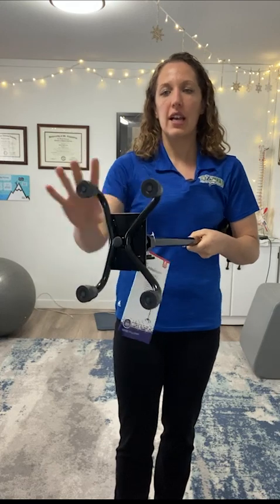Quad canes come in two sizes. I have here a small base quad cane. You can see it has four feet — one, two, three, four. This is a small base; it's a smidge wider, longer than my hand. You can get them bigger if you need more stability. Smaller base of support is less stable; bigger base of support is more stable.